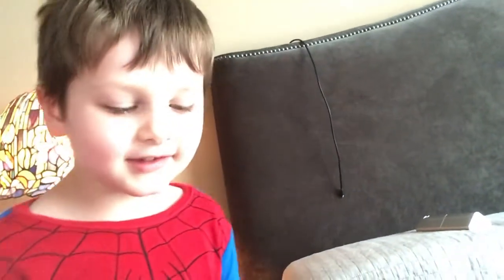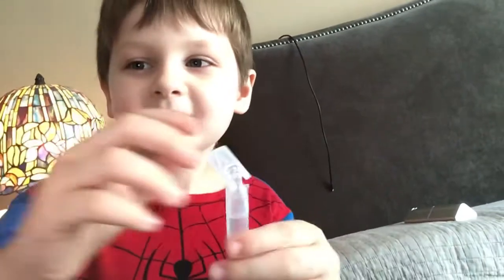Hey guys, it's me Alexander, and today I'm going to be putting this inside this. What is it? It is called nebulizer solution. Nebulizer solution that's going into a nebulizer machine.